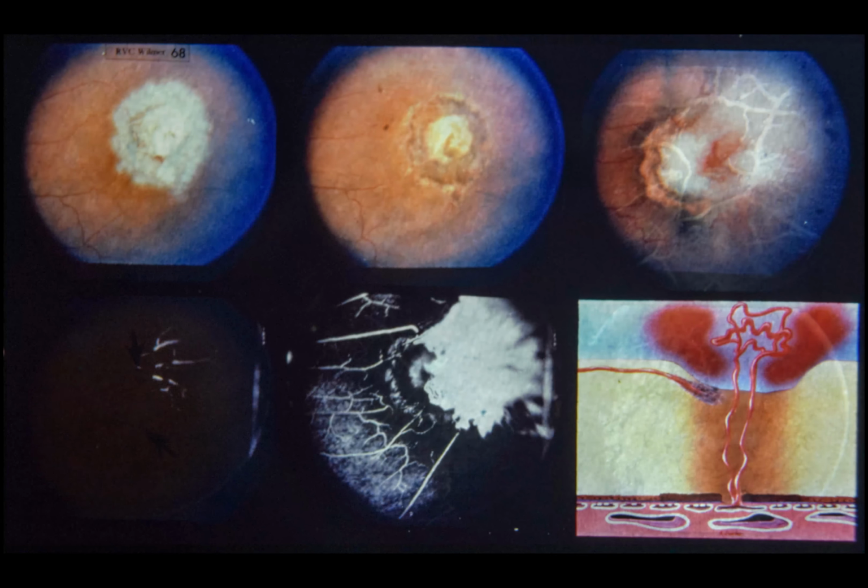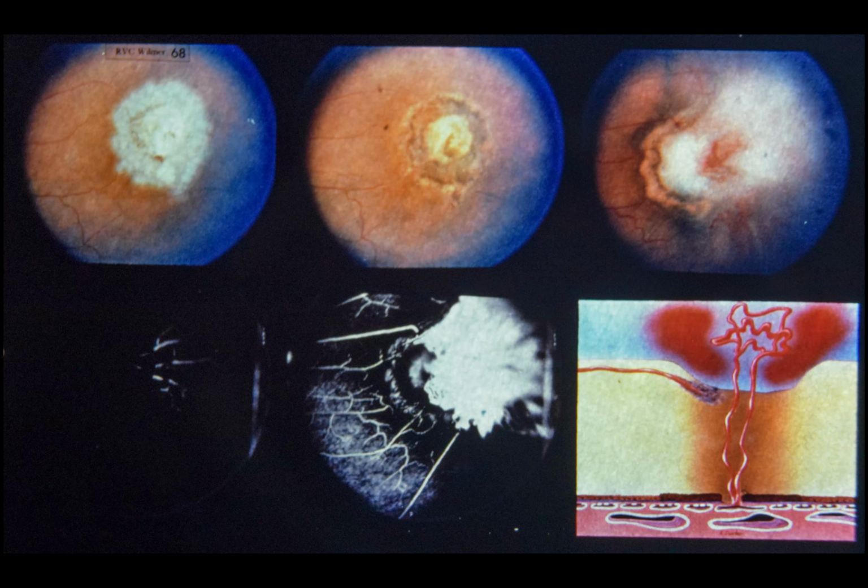Slide 68. Choroidal vitreal neovascularization developing after photocoagulation for retinal neovascularization. This 42-year-old white male with Eales disease was described in slide 67. It was difficult to cause fragmentation in the small frond of neovascularization in the temporal periphery of the left eye, thus necessitating increasing energy and exposure time in an effort to fragment the vessels. A 200 micron beam diameter at 700 milliwatts power and 0.5 seconds duration was used.